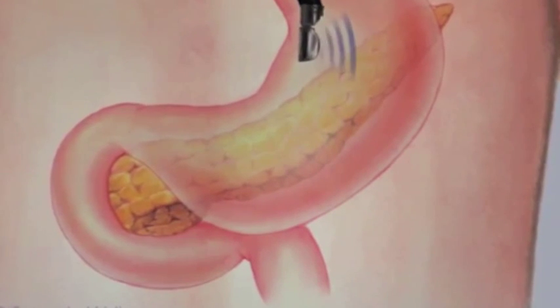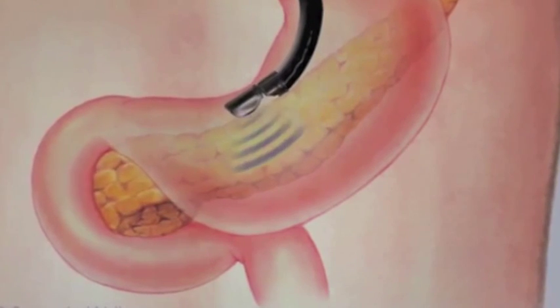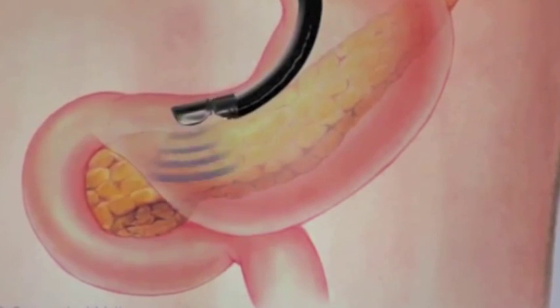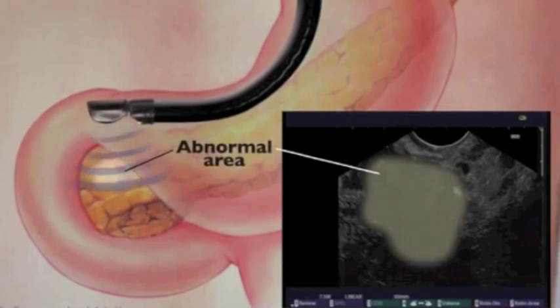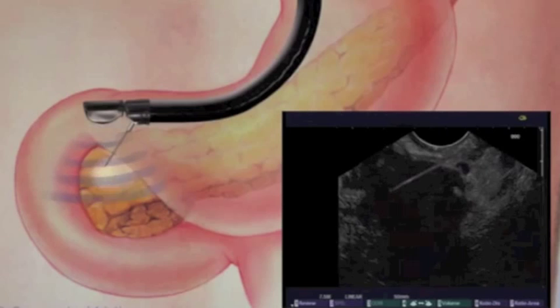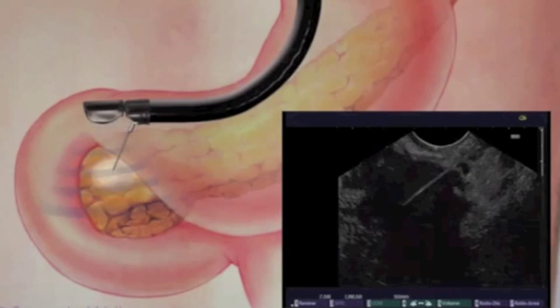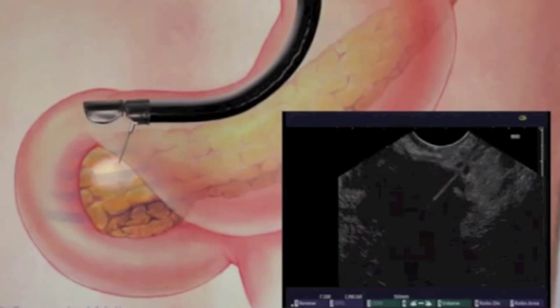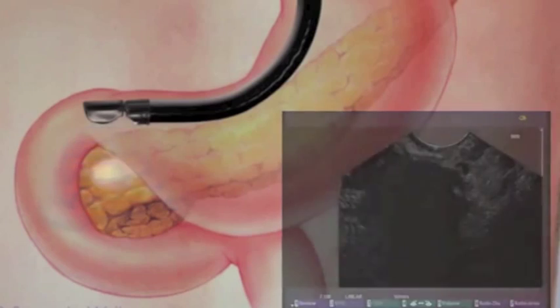EUS-FNA is important to help doctors correctly diagnose the type of pancreatic abnormality so that the patient may receive appropriate treatment. Once an abnormal area of the pancreas has been located, a very thin needle is passed from the tip of the endoscope into the abnormal area under continuous ultrasound monitoring. This fine needle biopsy is painless. Once samples have been obtained, the needle is removed.